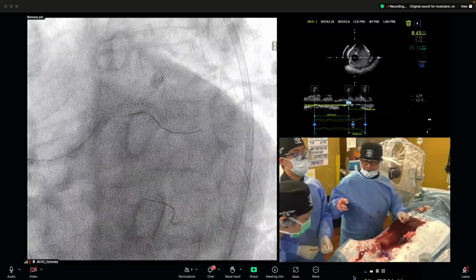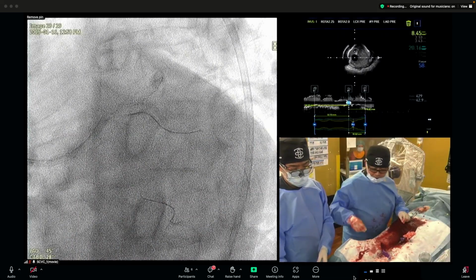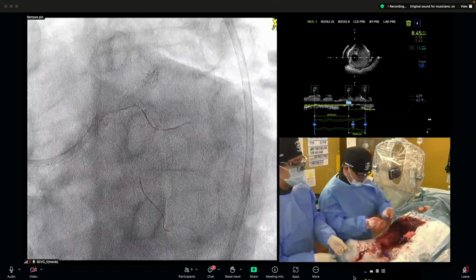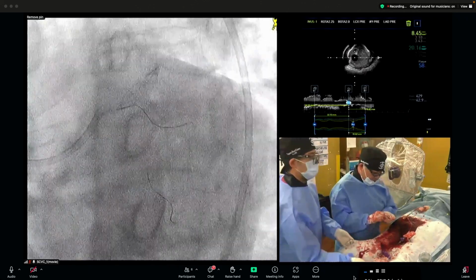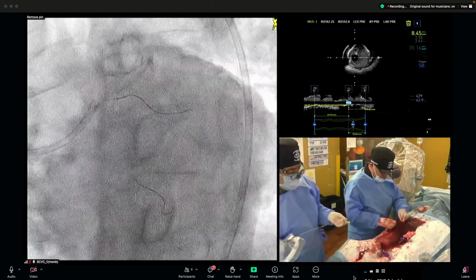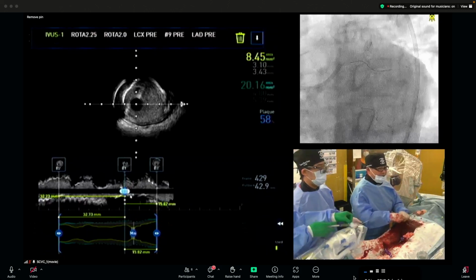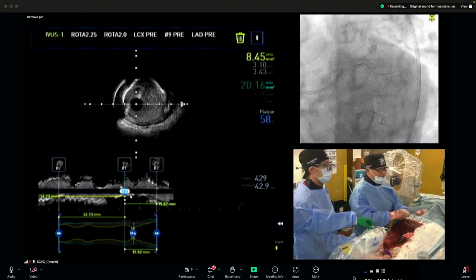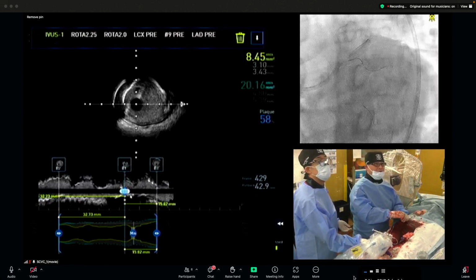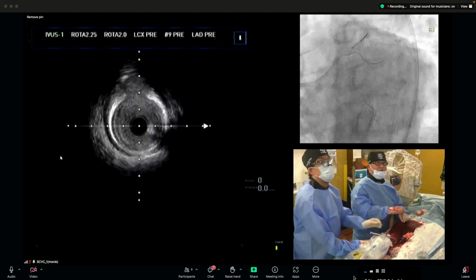Expand the proximal side. What mm for the POT? Okay. I want to do the POT technique after that, and I want to check with IVUS. However, Kuramichi sensei advised me, yes, so IVUS first, please. Okay, IVUS, turn it on. Okay, please put it back.